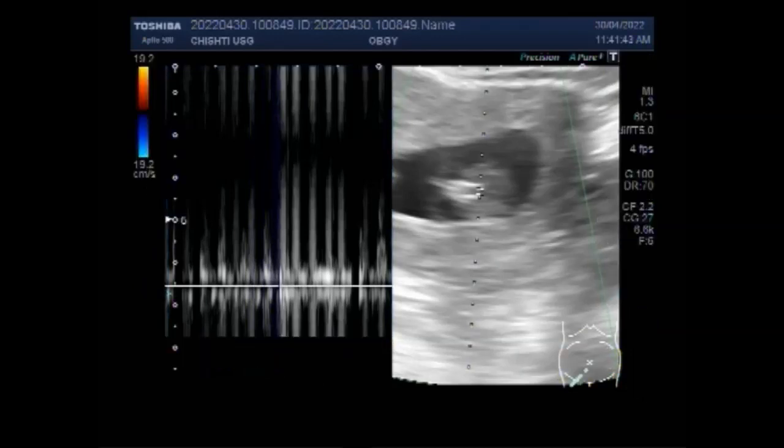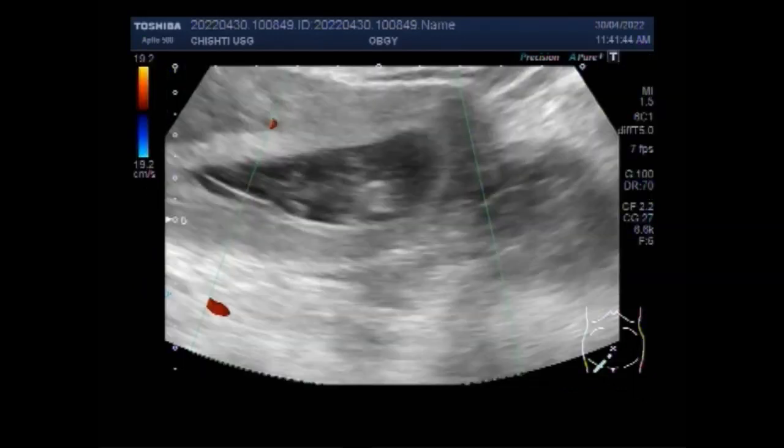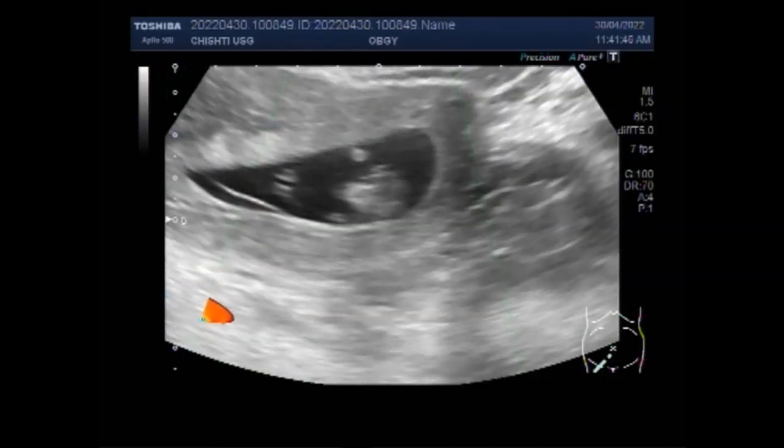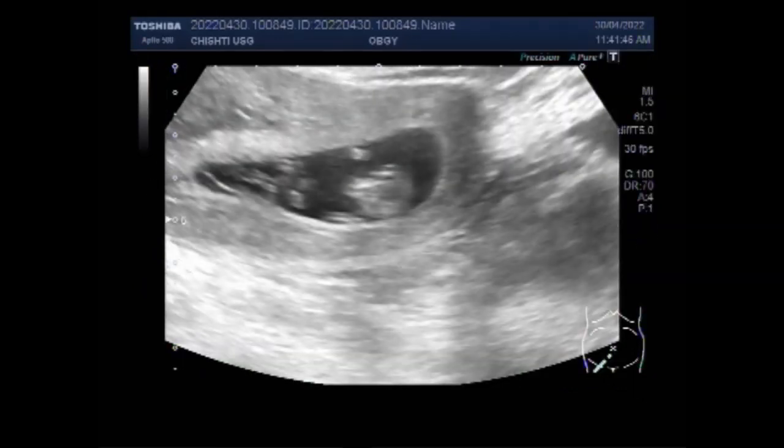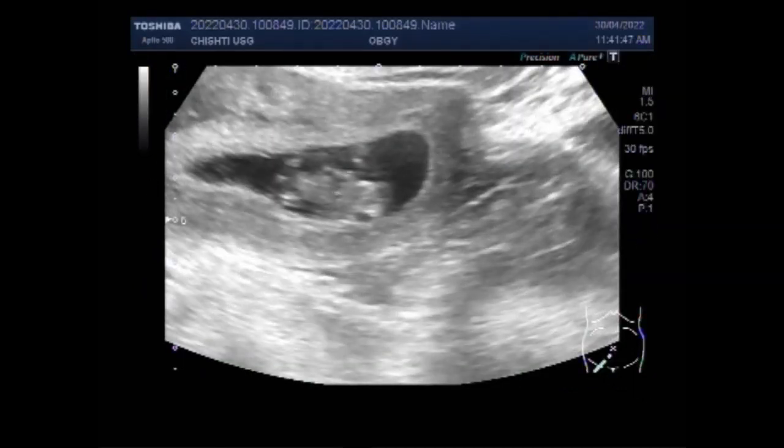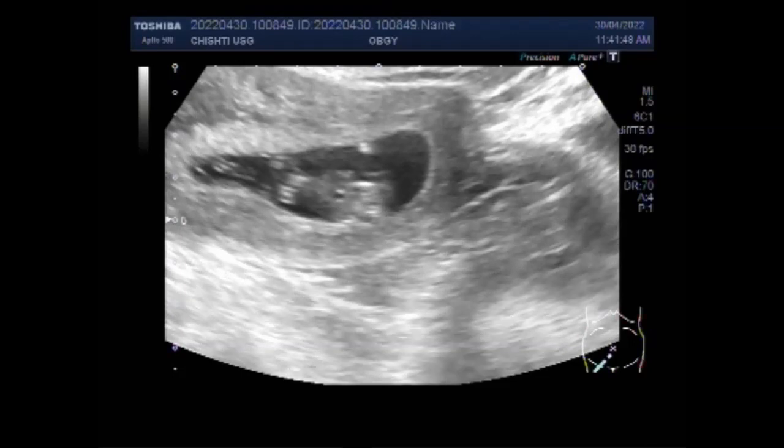You can now see the fetal heart with fetal cardiac activity, and blood flow is also visible.